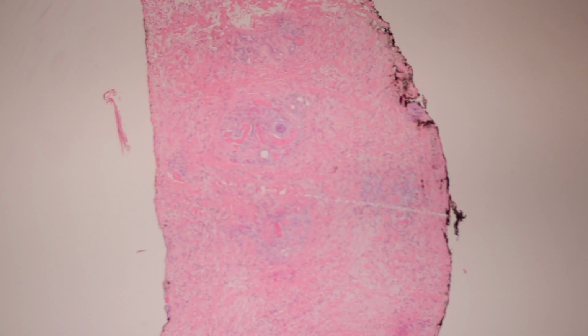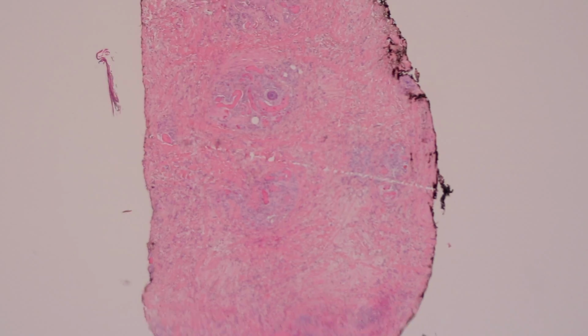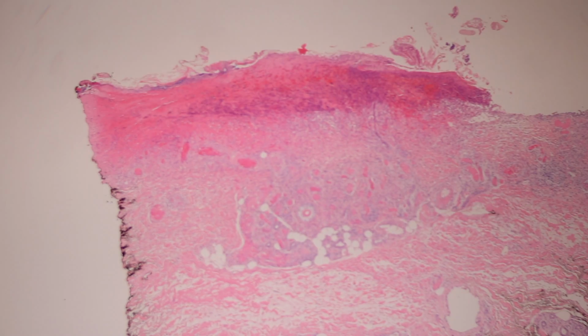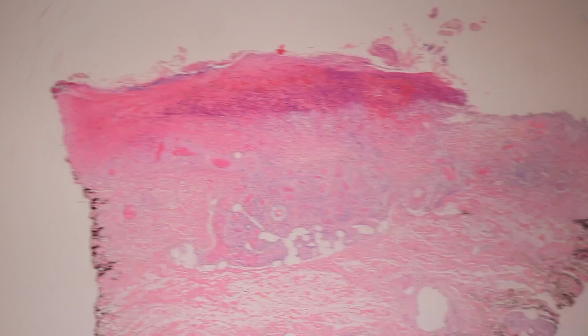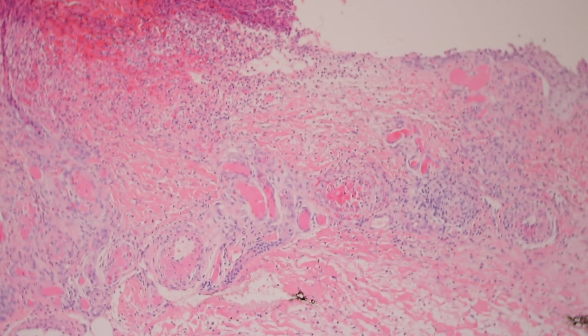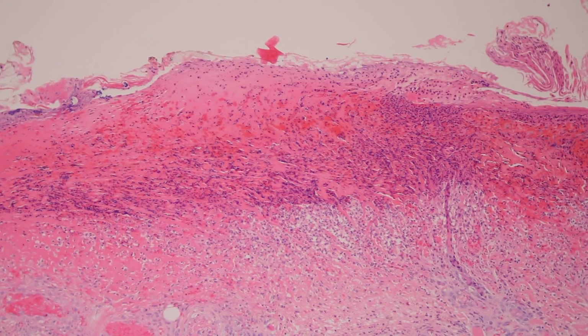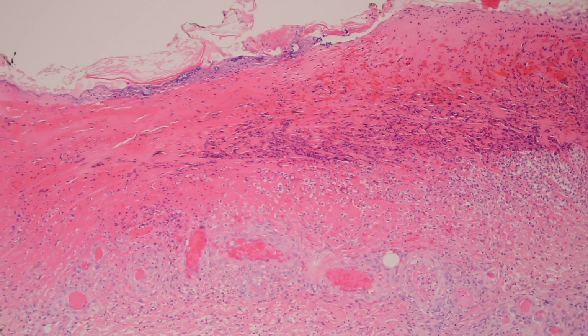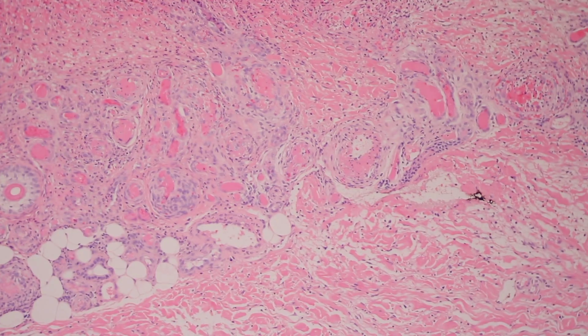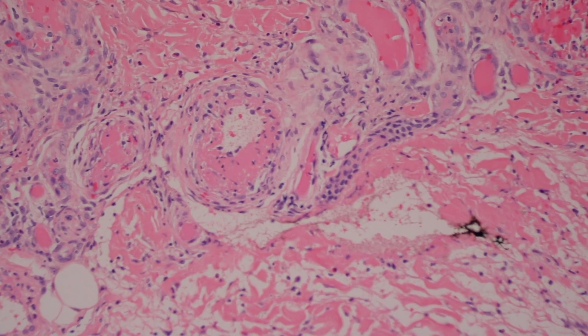Okay, here's another thing that has a little bit of a similar appearance microscopically. That's a funny cut where the tissue is embedded a little bit funny, but here, that's the normal. And this, the epidermis is completely eroded or ulcerated away. And so I told you have to be careful in that setting, but sometimes you will see vasculitis where there's just ulceration over top. And that's all a bunch of crust up there, or scab, basically a bunch of fibrin and neutrophil debris. And underneath it, though, you can see lots of vessels here, and the vessels are dilated, and they're filled with pink material.